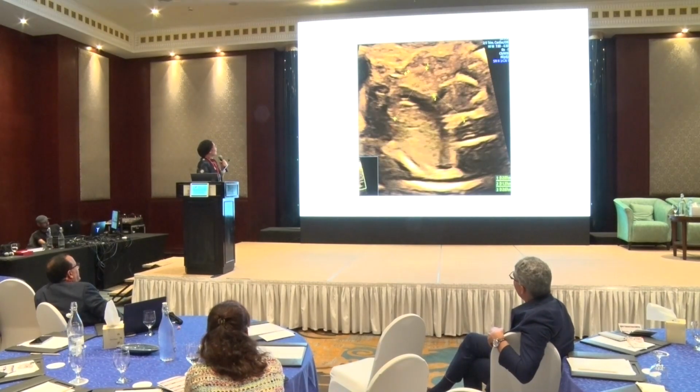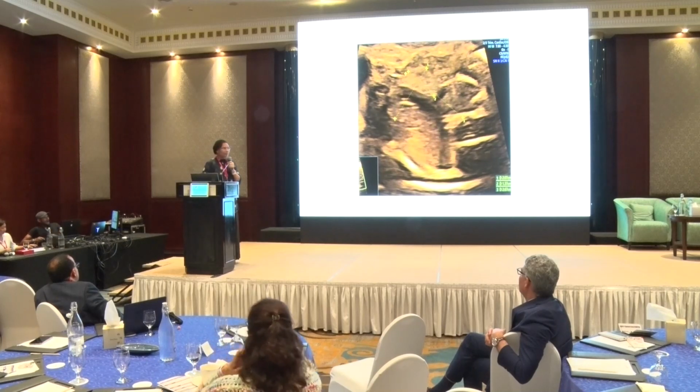Okay. So this is an important point, to look at the thymus. Again, what we practice in regular scanning will only become part of the practice. So we will look at the thymus all the time at the 3-vessel view, 3-vessel trachea view, to make our eyes used to how the thymus looks, in order to pick up DiGeorge syndrome.